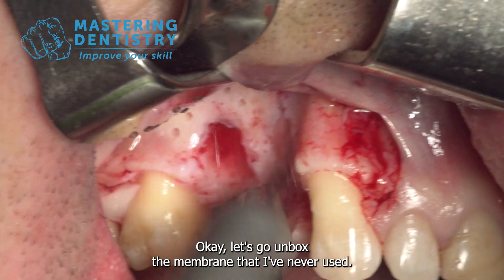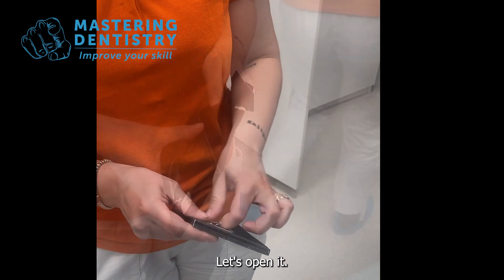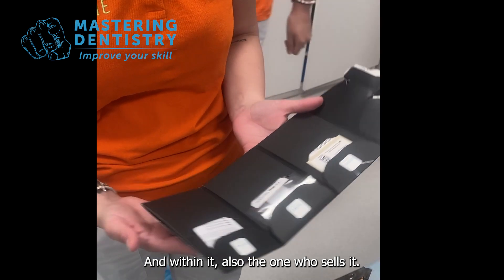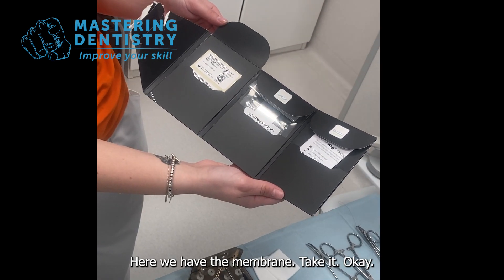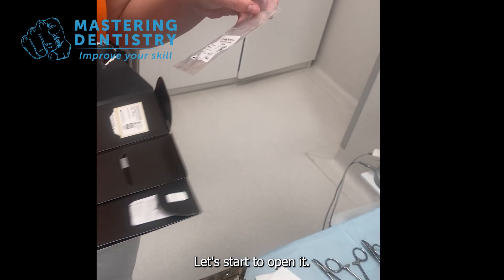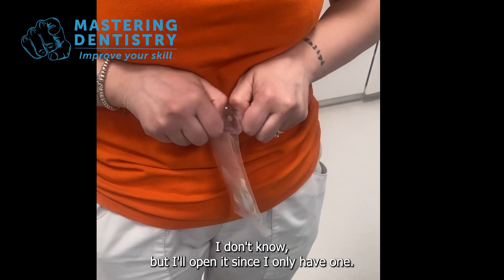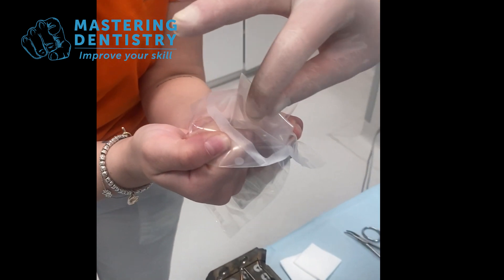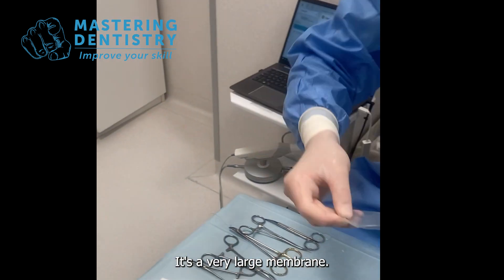Let's unbox the membrane that I've never used and never seen before. I'm not affiliated with the manufacturer — they gave it to me. Inside we have the membrane in a second sterile package that you should not touch. I'll open it since I only have one. We bring it to the operation table — it's a very large membrane. Let's try not to touch it with steel, as the manufacturer advises that steel might compromise the slow resorption of the magnesium membrane.